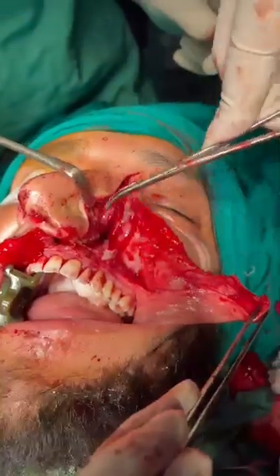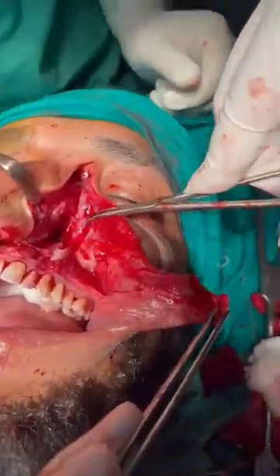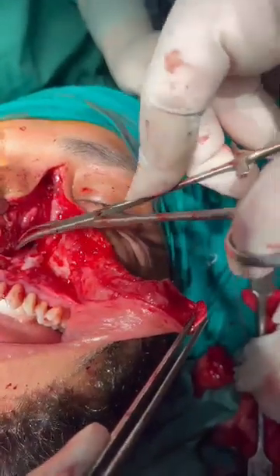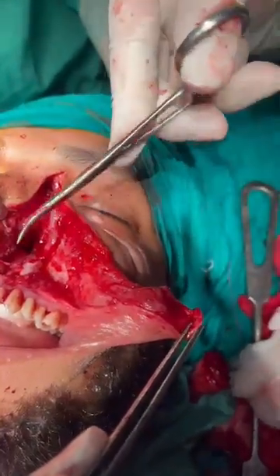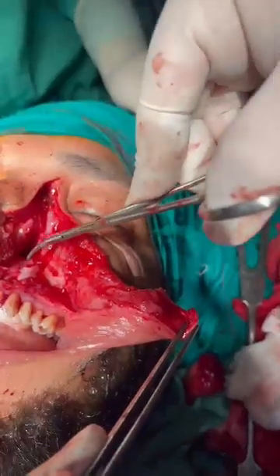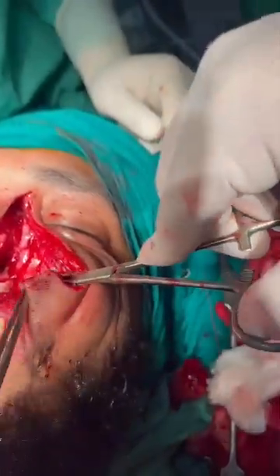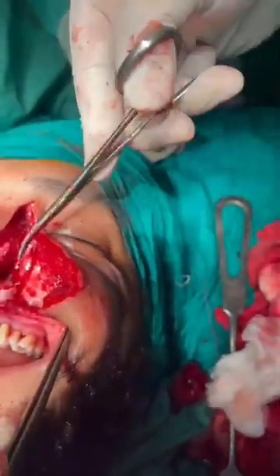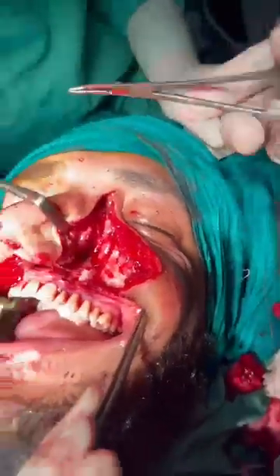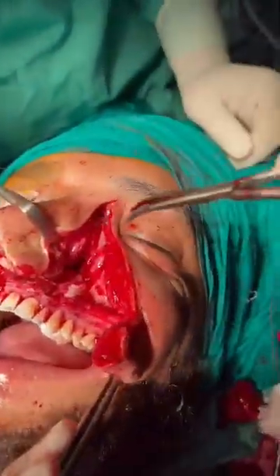This is mucosal. This is osteotomy — we have done osteotomy of the nasal-maxillary region. This is termed medial maxillectomy; we have removed this for access to the tumor which was entered here.